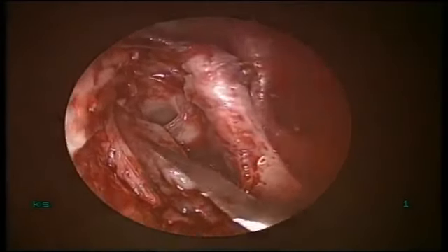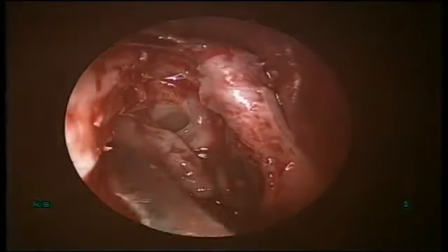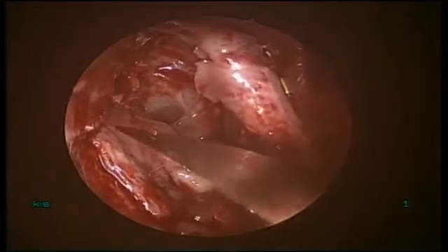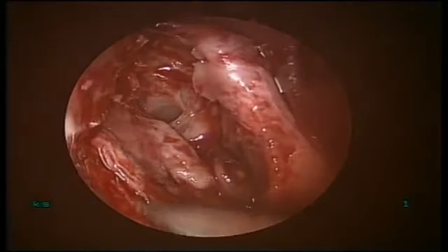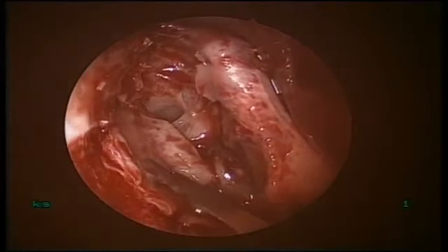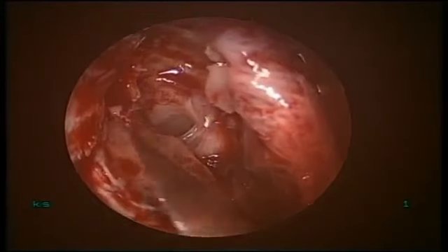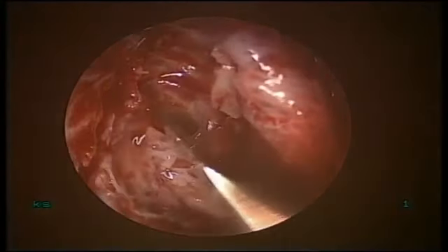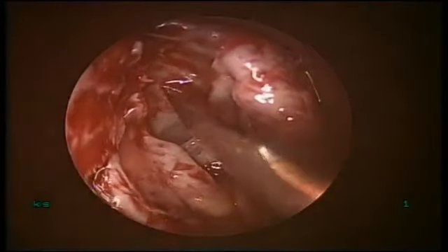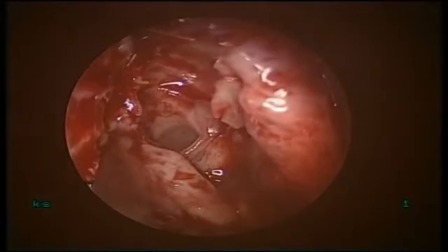Can you see that? Yes, sir. And similarly for the upper part. And this flap is coming here anteriorly like this. Can you see that? Now the entire duct is marsupialized. See, on all sides.